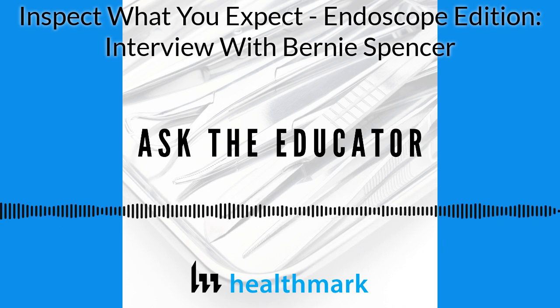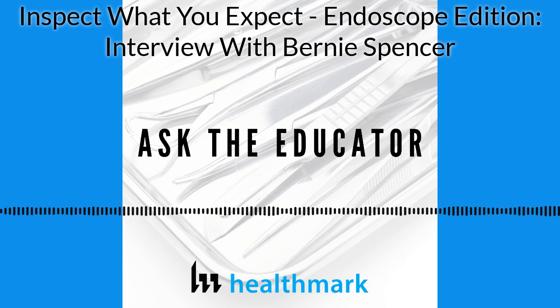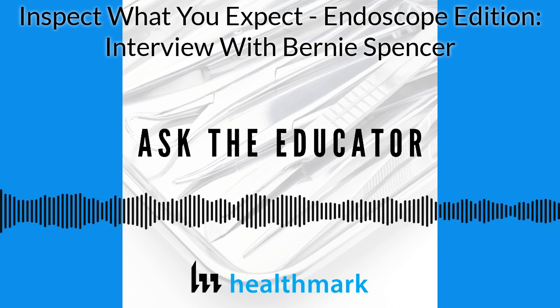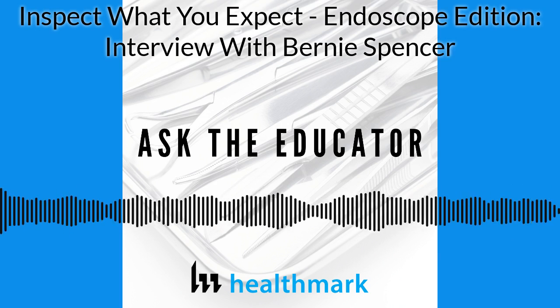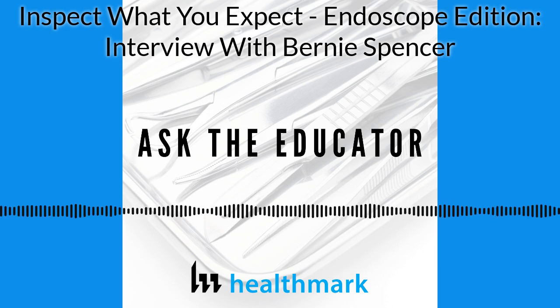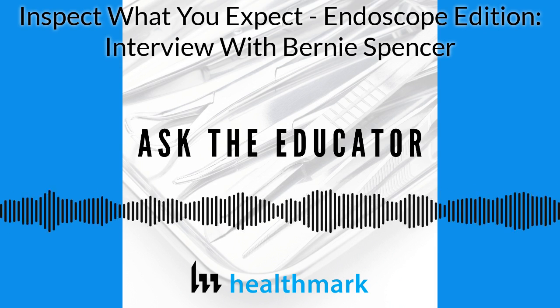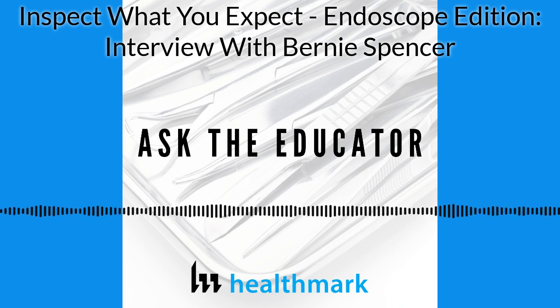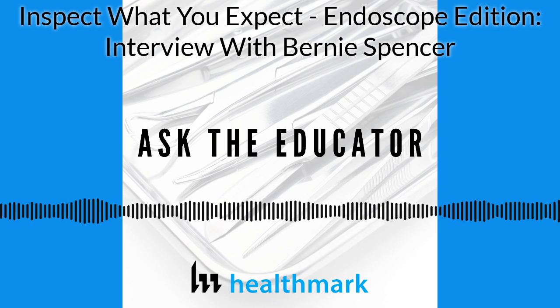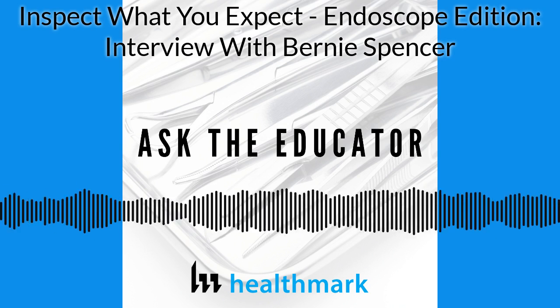All right, let's do a short recap of this episode. I spoke with Bernie Spencer, a surgical technologist and SPD technician, and he shared with us a few principles that he learned back in his automotive manufacturing days and how they apply in the device processing world. One principle that he spoke of that came from Edward Deming says to inspect what you expect. And Bernie applied this principle to endoscope brushing specifically. And he shared with us some things that he discovered, that even though brushing the endoscope channels appeared to be effective after visual inspection, it turned out that after using cleaning verification tools to check for cleanliness of the scope, it wasn't always adequately clean. So he then added this enhanced inspection step of cleaning verification to 800 endoscopes. So throughout that process, Bernie was able to identify endoscopes that needed repeated cleaning and endoscopes that needed repair. I'd say it was a good thing that Bernie decided to inspect what he was expecting from his endoscope cleaning procedure.